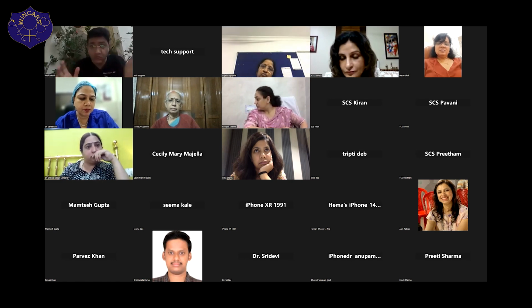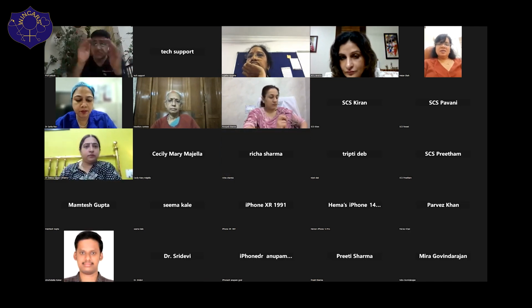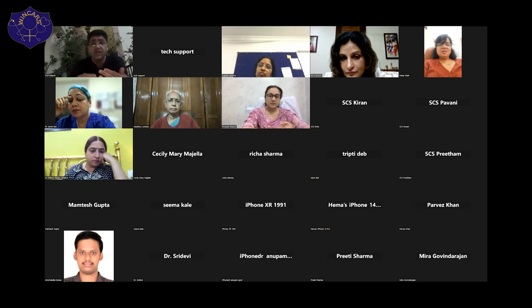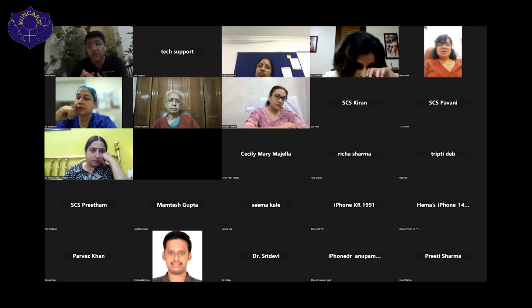We do use it. We take out our POT balloon earlier in the case for the step crush, and we really feel that it's not always possible to have a zero metallic carina. You will always have some metallic carina, and as you rightly pointed out, it may be angle dependent also. But now we are doing one observational study. We are seeing that our new metallic carina using these modifications is much smaller as compared to the conventional DK crush.